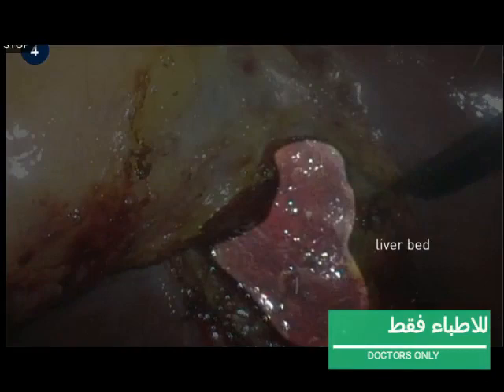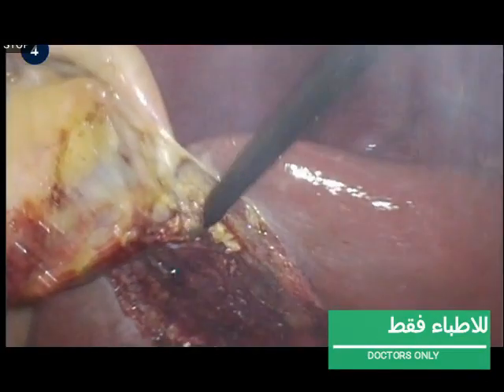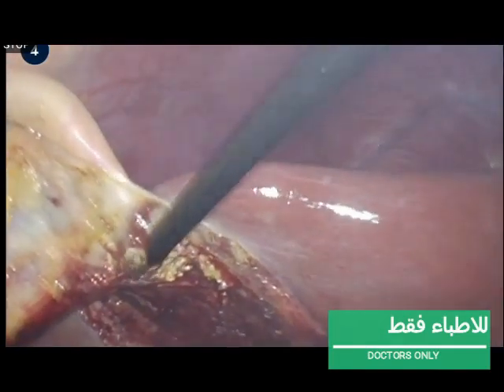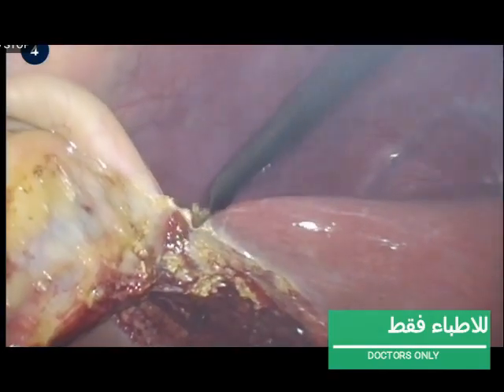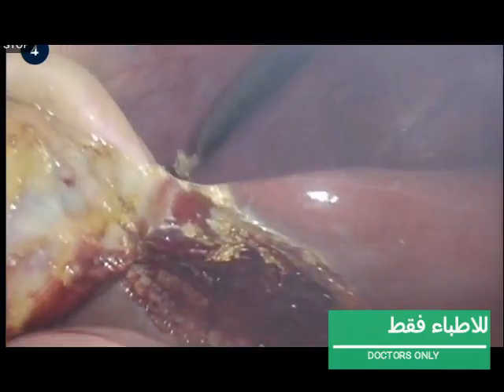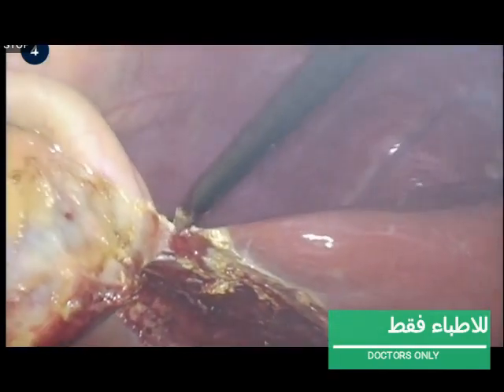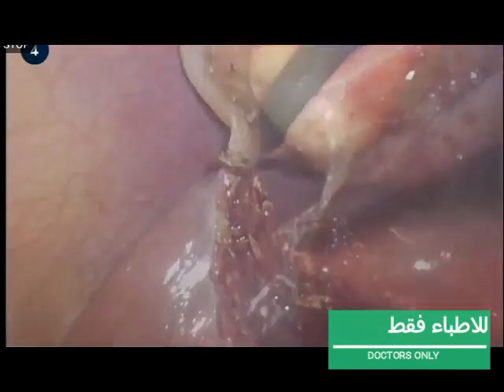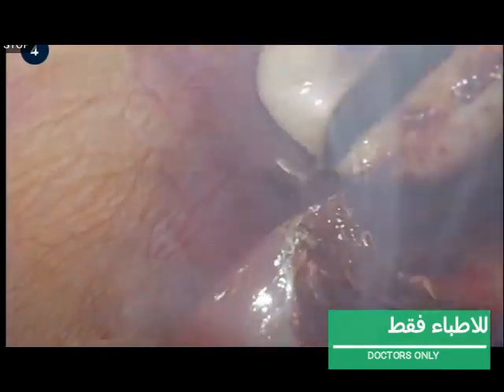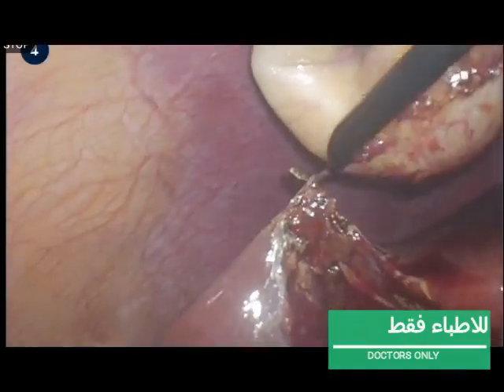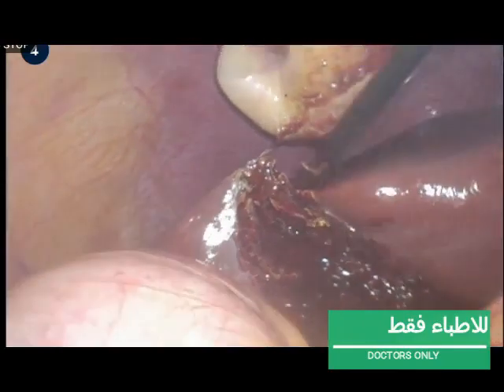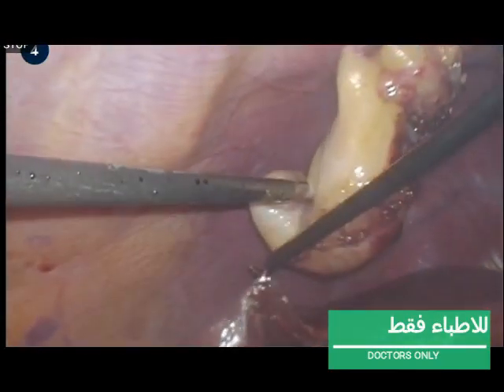Here you can identify the liver bed. Keep careful traction on the gallbladder and dissect the correct plane until the whole gallbladder is dissected off the liver bed. When the gallbladder is connected to the liver through only a small piece, it could be a good moment to irrigate the liver bed. Here, the gallbladder is fully dissected off the liver bed.